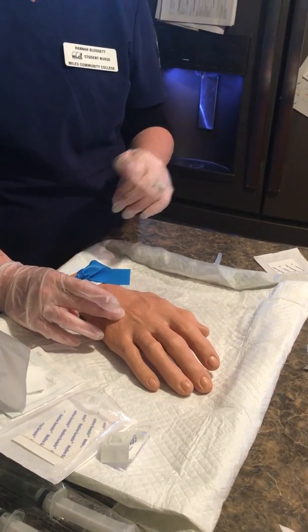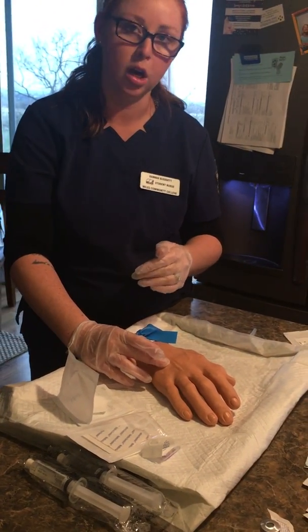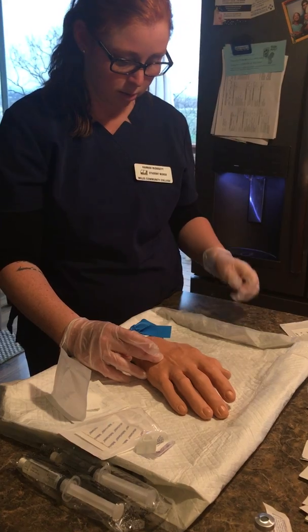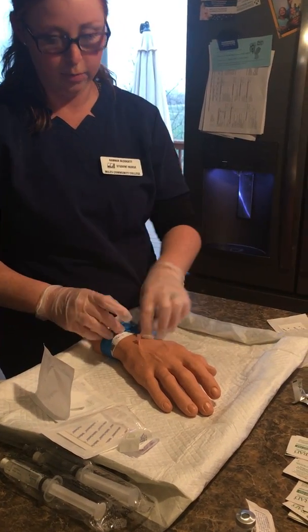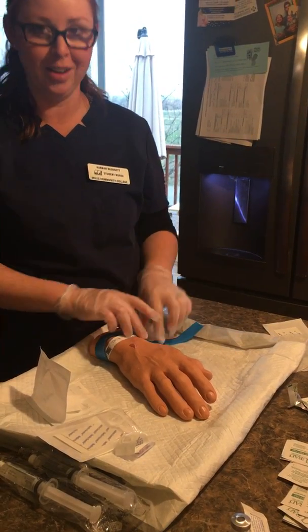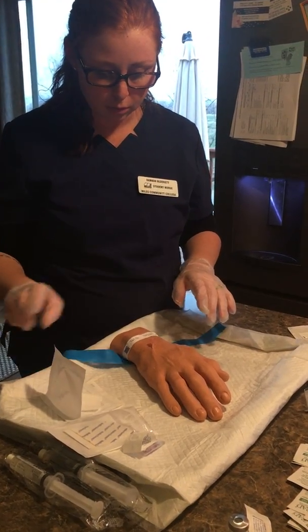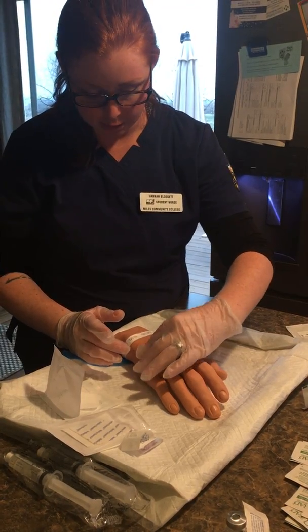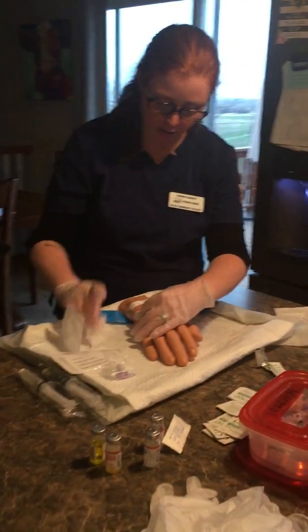Definitely before you insert completely, you want to identify that you have a flash and you're in the vein, and I would definitely take that off before I actually inserted anything. So at this point, I want to make sure that this stays stabilized.